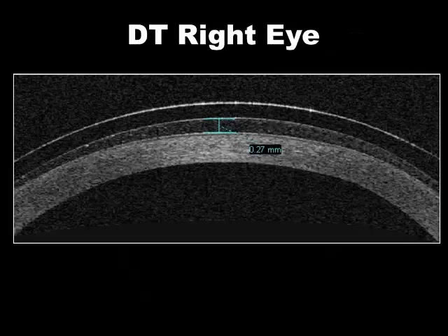When we OCT, this lens went on eye with 270 microns. One can expect a similar settling with the smaller diameter scleral lens, probably 100 microns, maybe a little bit more. So always best to have slightly more fluid on insertion.